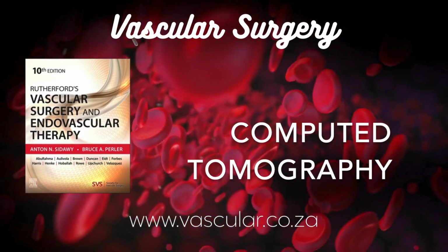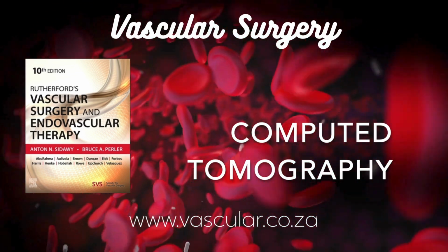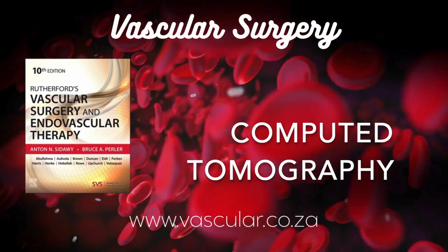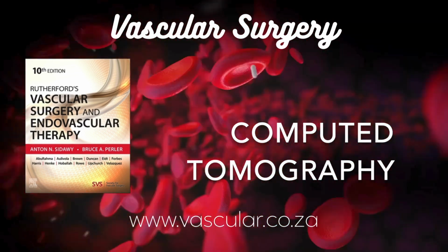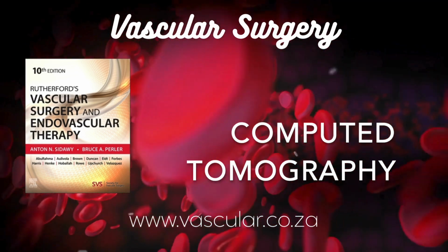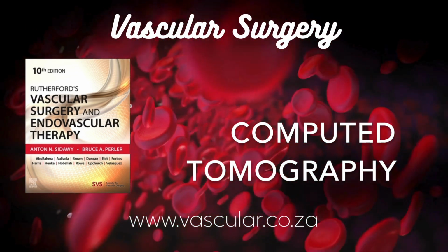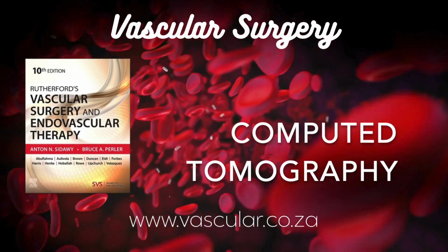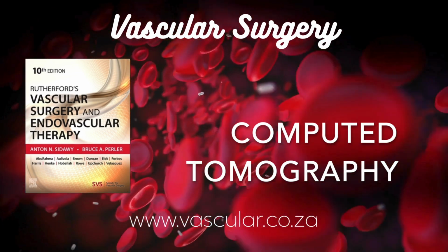Definitely. There are also techniques like split bolus injections. Split bolus. Yeah, where you give parts of the contrast dose at different times. This allows you to potentially capture both the arterial phase when arteries are brightest and the venous phase when veins are bright, all within a single scan acquisition. Saves the patient an extra scan and extra radiation dose. Neat trick. Any other contrast factors?